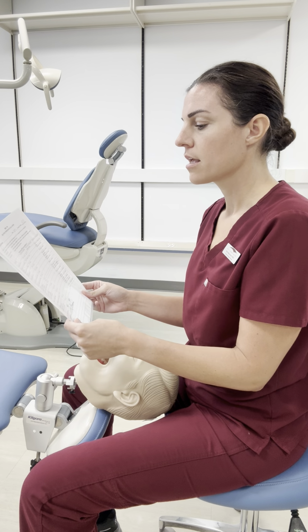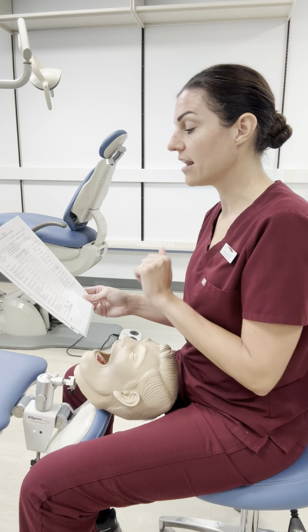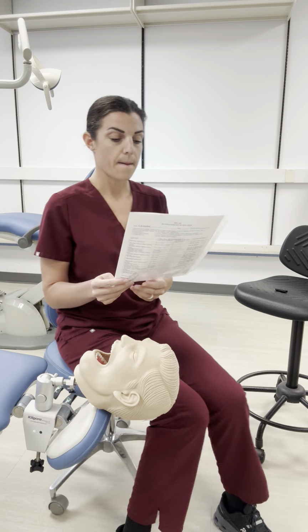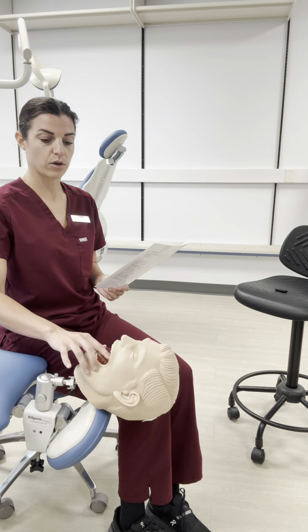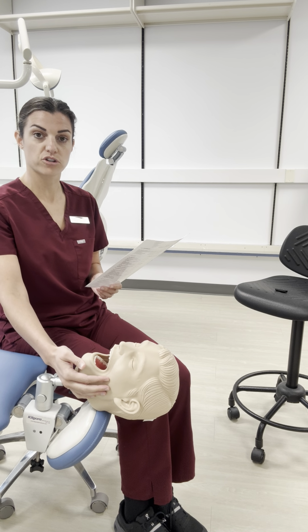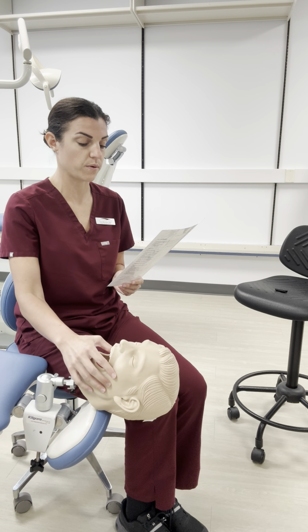Okay, maxillary left lingual, we're going to be at 8 o'clock. The chin is going to be up and neutral. Sometimes they can be up and away so that you can see it a little bit more directly, but our sheet says neutral, so we'll go with that.